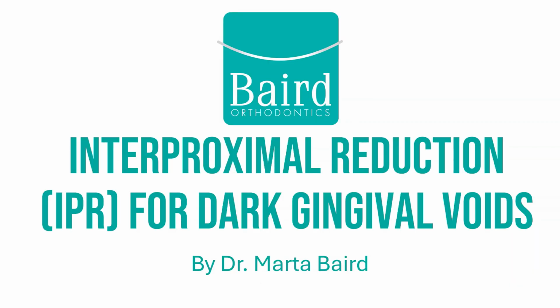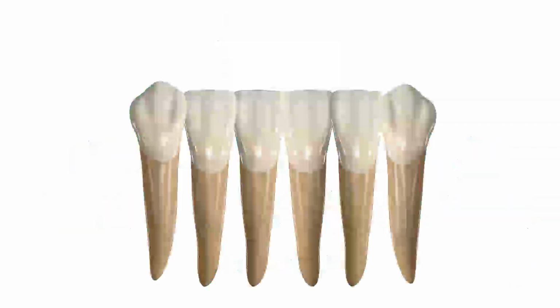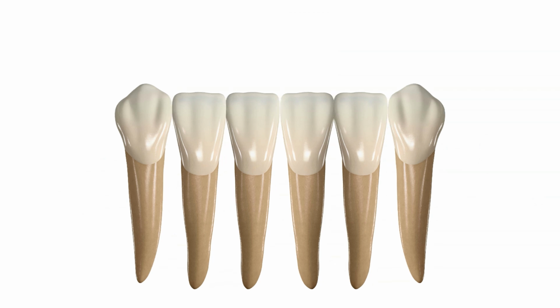Sometimes we use interproximal reduction for the correction of dark gingival voids. When crowded teeth are aligned for some adult patients, in between the teeth, the gum tissue does not fill that space. It's because adults are no longer growing. These dark areas are called dark gingival voids.